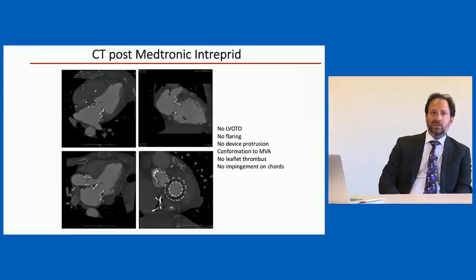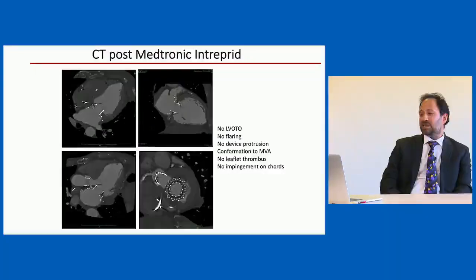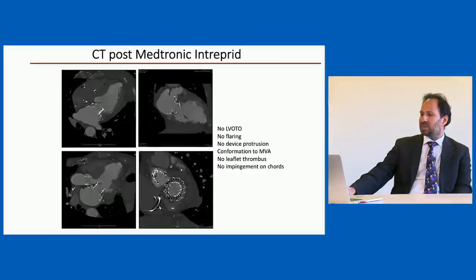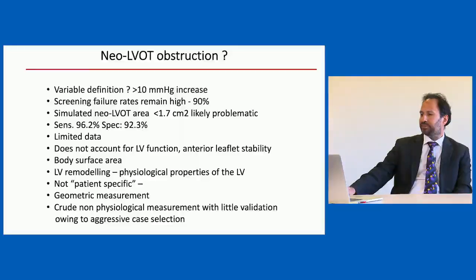Another consideration with transcatheter mitral valve therapies is whether or not these devices are prone to develop thrombus on their underside, and for this reason it's important that the ejection fraction remains not severely impaired at the time of deployment. Typically an ejection fraction of 30% would be considered a reasonable cutoff, though some devices will propose a slightly lower cutoff of 25%.